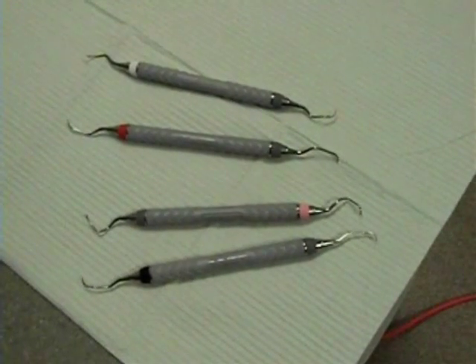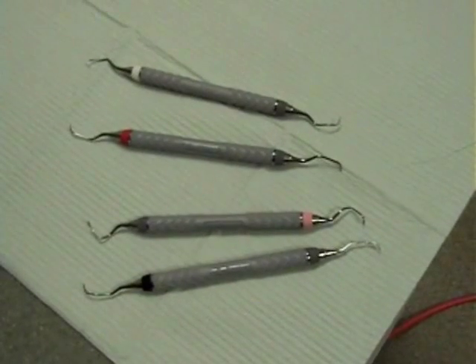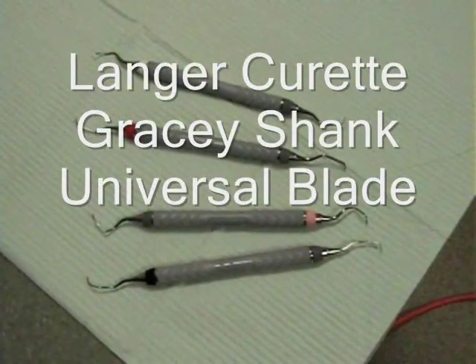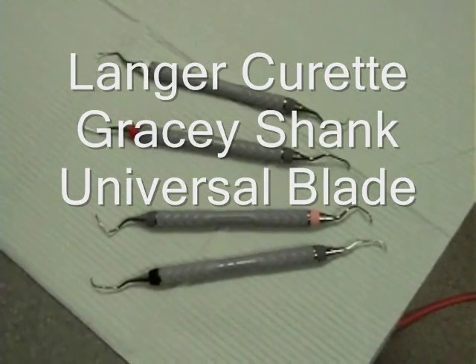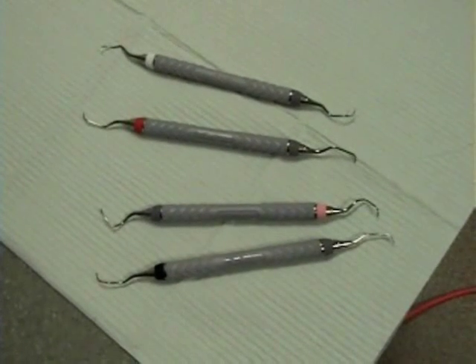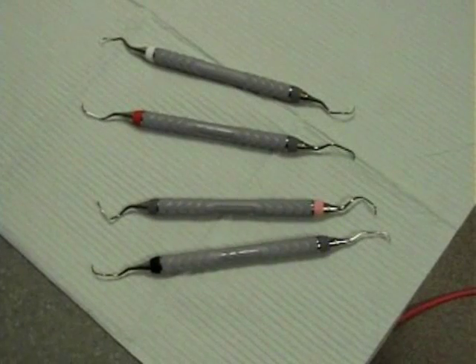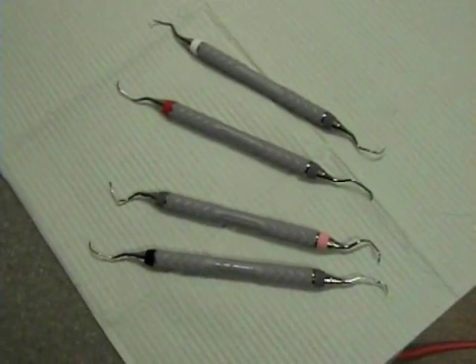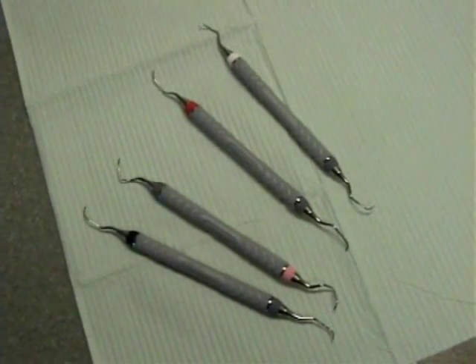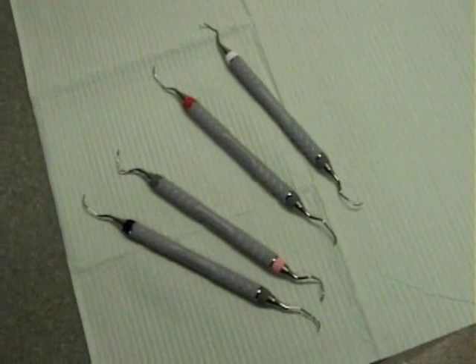Another set of curettes is called the Langer curettes. They were designed by Dr. Burton Langer, who's a periodontist. They combine the best features of the Gracey shank with a universal curette blade. This allows you to scale the mesial and distal surfaces with the same instrument. The Langers have a slightly shorter and thicker terminal shank, making them less flexible. The shank is not parallel to the long axis of the tooth when a good working blade angulation is achieved.